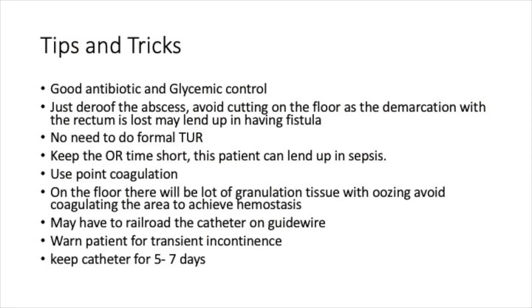Good antibiotic coverage and glycemic control is a must for doing de-roofing of prostatic abscess. Just de-roof the abscess and avoid cutting on the floor, as the demarcation with the rectum is lost and we may end up with a fistula if we cut more on the floor. We did not do a formal TURP in cases of prostatic abscess, as once the abscess is de-roofed and pus is drained, the fossa gets collapsed and we have a wide fossa.